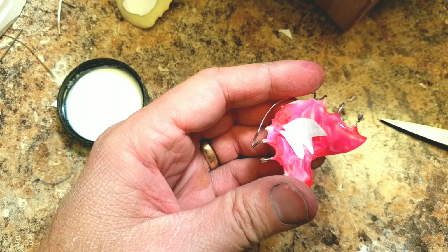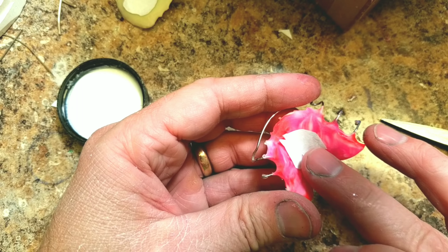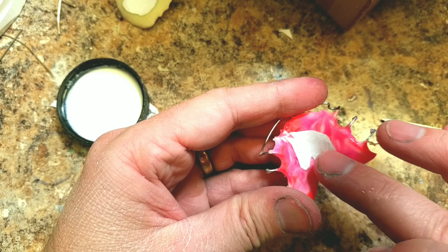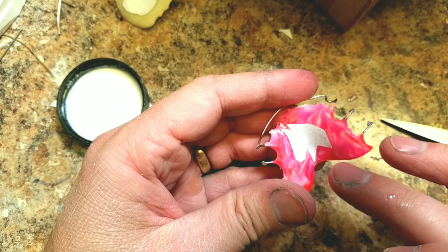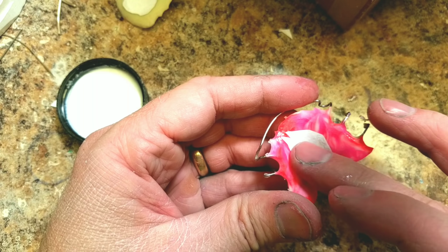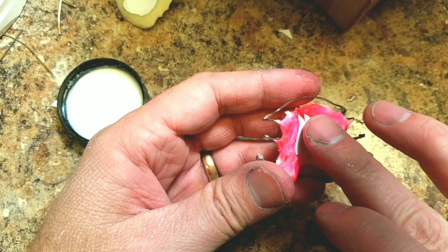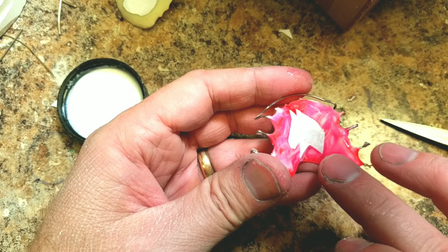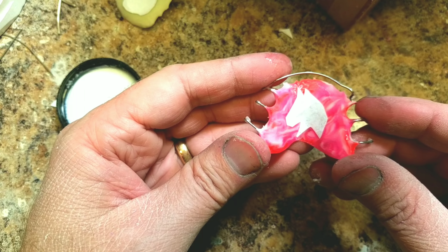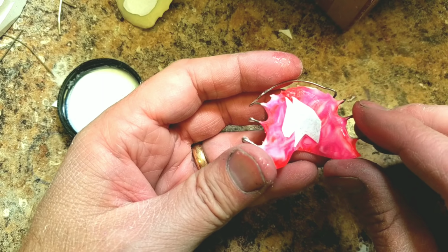Now here's the best part, is I can move it around until I get it to where I want it to be. And it'll just get rid of the air bubbles, if there's any. There's no. This one was a really good transfer. It's going right on. And I can move it, like I said, to get it perfectly placed. And I'm going to let this sit and dry for 20 minutes.